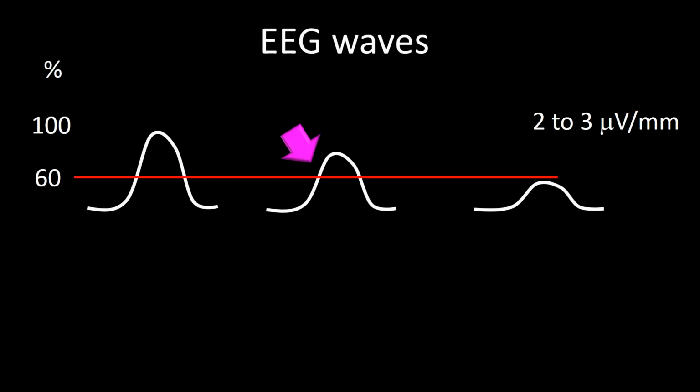Most brains do not end up injured in the presence of a 60% drop in amplitude of the EEG activity for a relatively long period of time. A drop in amplitude of more than 60%, if it persists beyond 6 to 10 minutes, is likely to be associated with postsurgical neurological deficit.